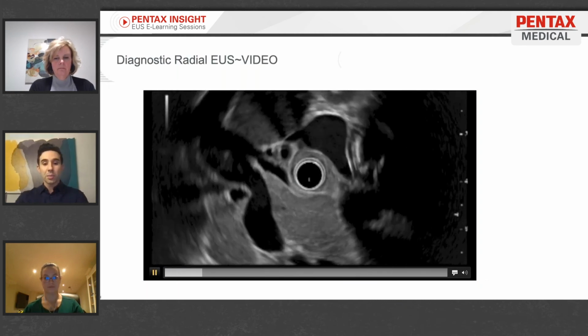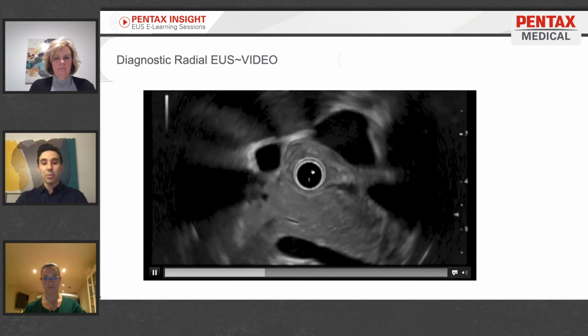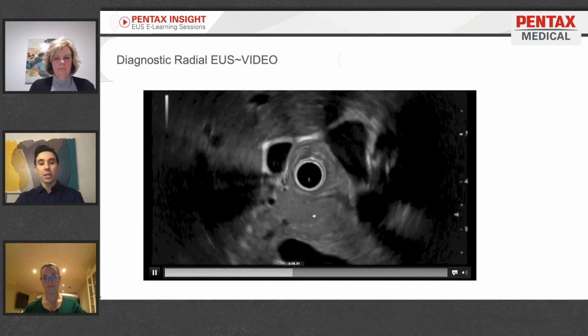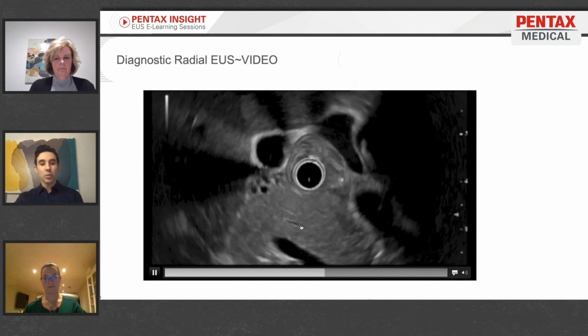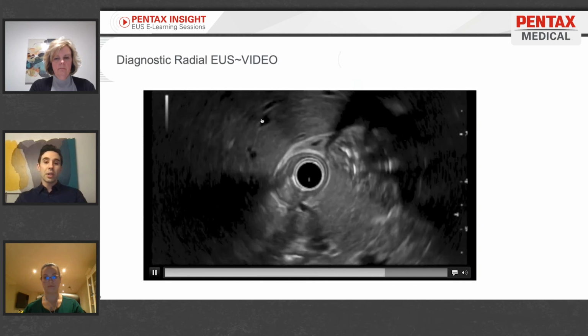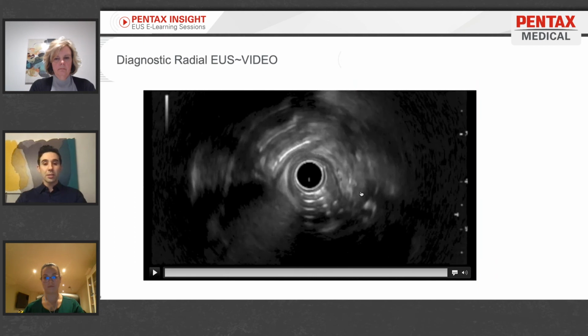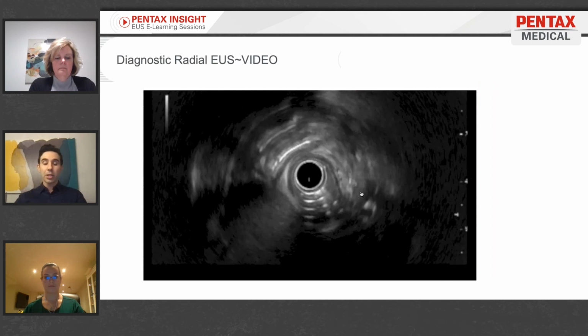So this is that splenic vein structure here. And again, if I find the splenic vein and I have my probe, I know right between it should be the pancreas. This little structure that you see wisping through it is the pancreatic duct. We have the liver up top here, the gallbladder. But really what I'm focused on is the pancreatic body. And so by using those vascular landmarks, we can examine the pancreas thoroughly and completely with the echo endoscope.